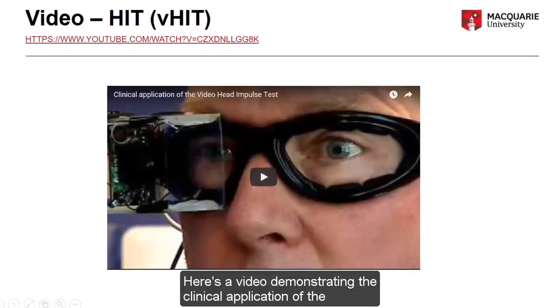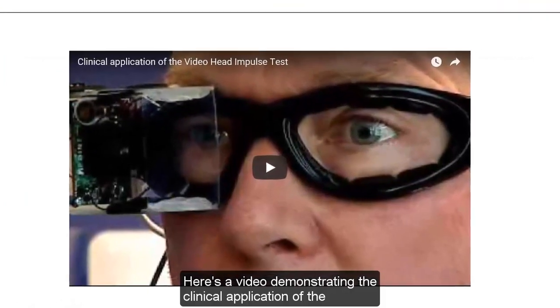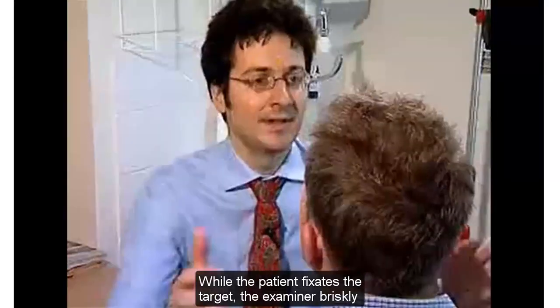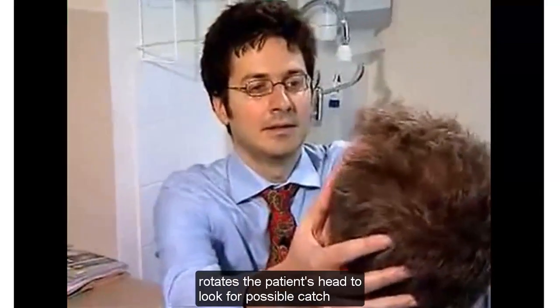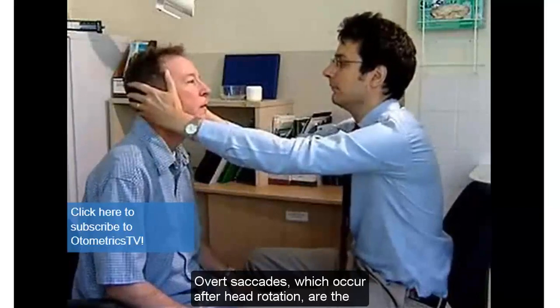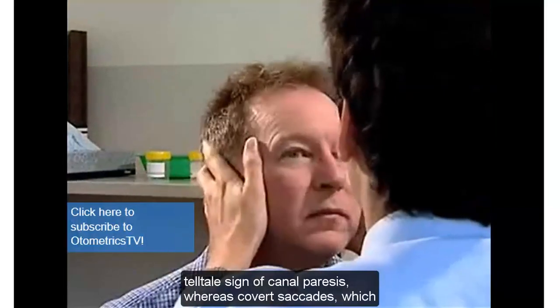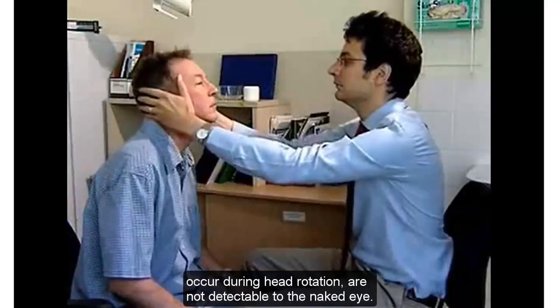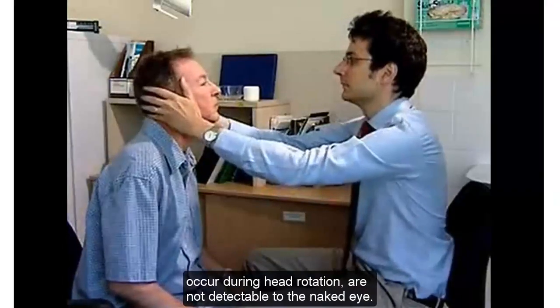Here's a video demonstrating the clinical application of the video head impulse test. While the patient fixates a target, the examiner briskly rotates the patient's head to look for possible catch-up saccades. Overt saccades, which occur after head rotation, are the telltale sign of canal paresis, whereas covert saccades, which occur during head rotation, are not detectable to the naked eye.